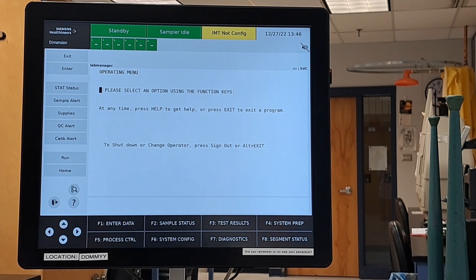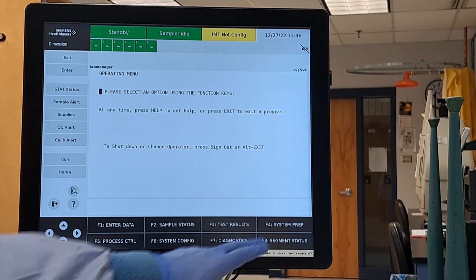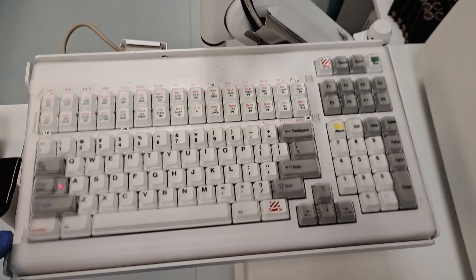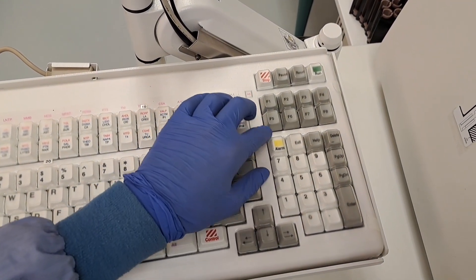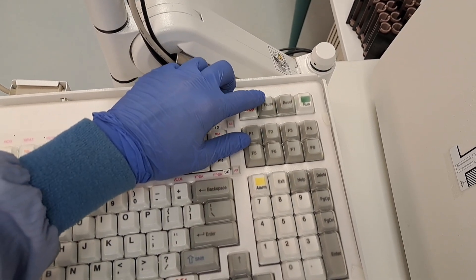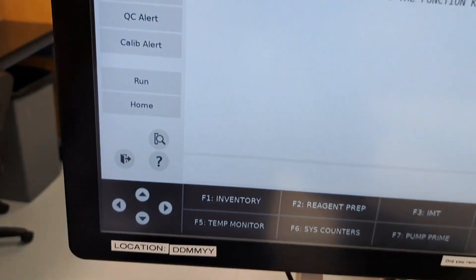Enter data allows us to enter our QC and patients. Sample status lets you see the status of what you're running. Test results lets you look at your test results. And system prep is where you may find inventory and process other types of maintenance. The important functions of our keyboard are our standard keyboard system. Your F icons are here. Exit allows you to go back one page. Alarm if it beeps at you. A hard stop in case there is an emergency. Pause to put the analyzer in standby. Reset after an alarm. And run — this performs the same function as the run on the monitor.